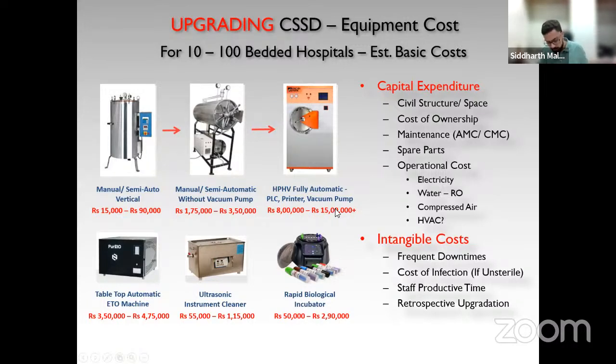Now, we understand if you have a smaller nursing home, it is not practically possible today to shift to an autoclave which is 10 lakh rupees, obviously. But you should have this in mind. Just the way you have been progressing with your drills, with your robotic systems, or for that matter, for your instruments, you are taking the best of the class instruments. Sooner or later, it is good to upgrade to better CSSD position, better kind of autoclaves.